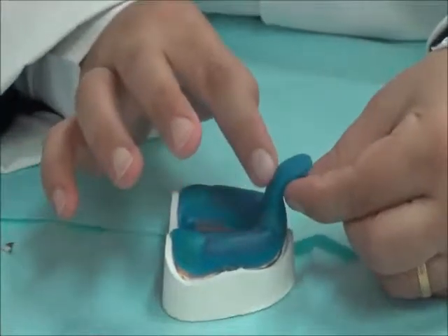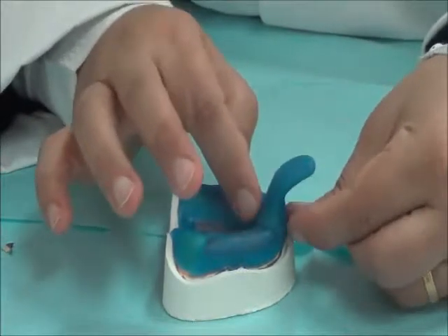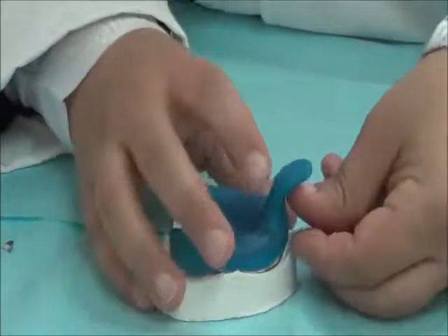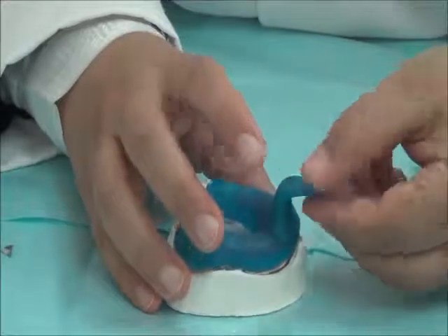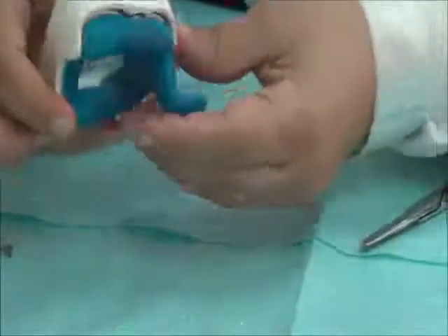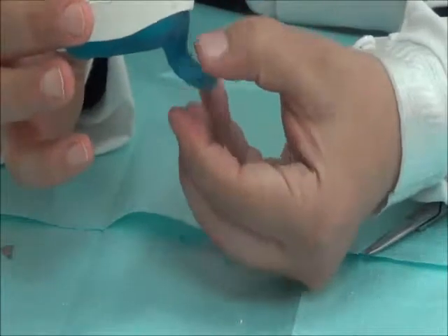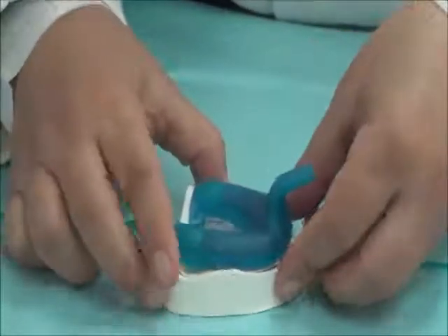The body goes up vertically or a bit labially, it's okay, but vertically is safer. And then the last bit of it bends to the outside and becomes flat. This provides a grip for the dentist when he's holding the tray in and out of the patient's mouth. So if this is the patient's upper mouth, the dentist has a grip to hold the tray and put it back. And now this is ready to be light cured.